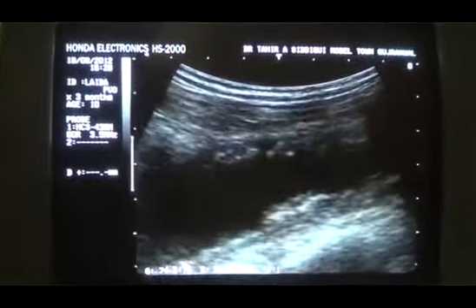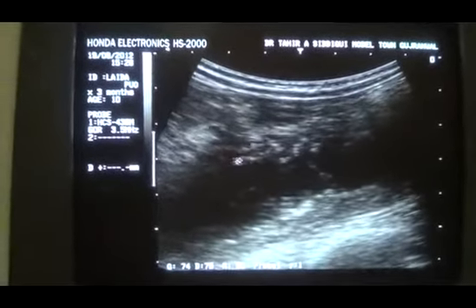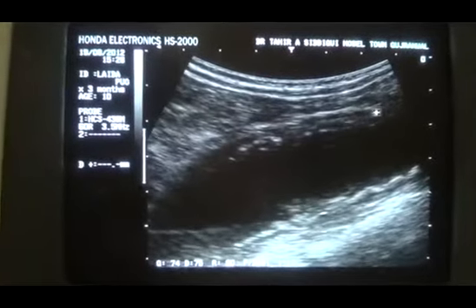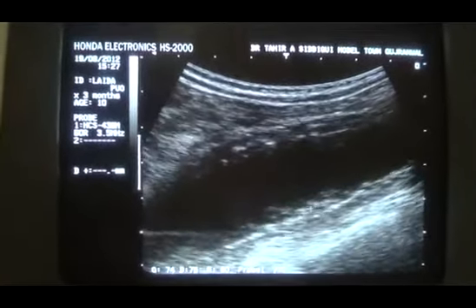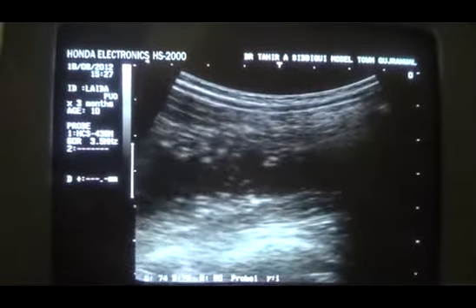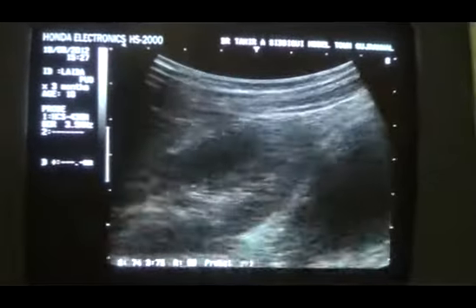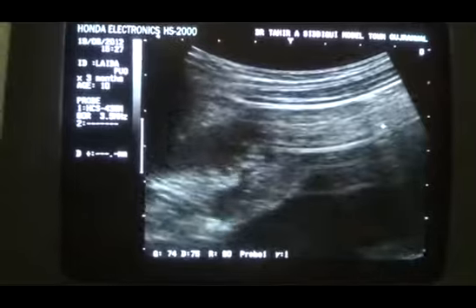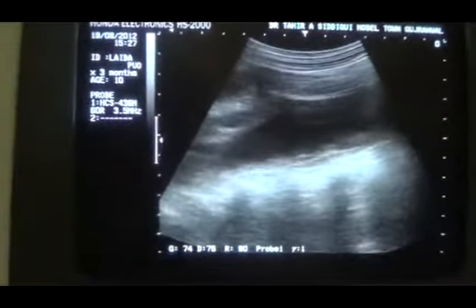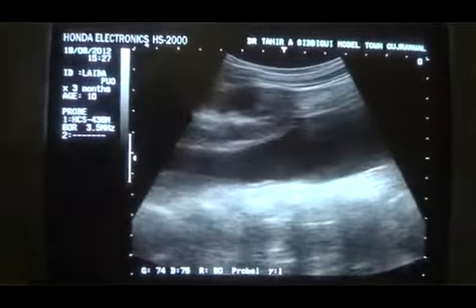And see that there are multiple, numerous echogenicities within the anterior and posterior wall of this cystic area. So this cystic area, being an abscess, has gone sterile, in fact, because he has been taking heavy antibiotics for the last 3 months.